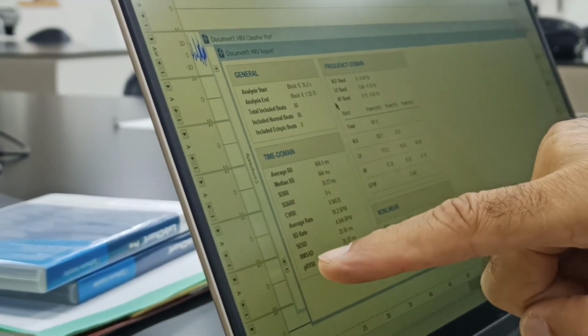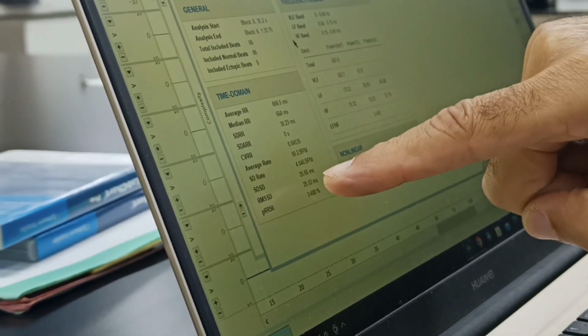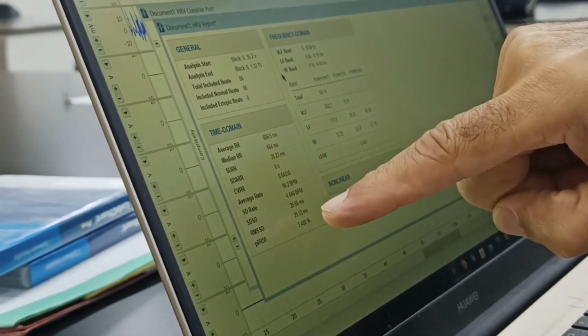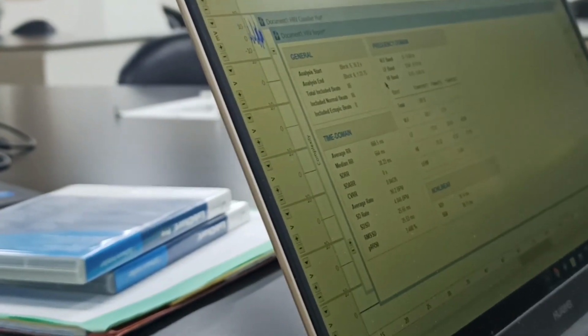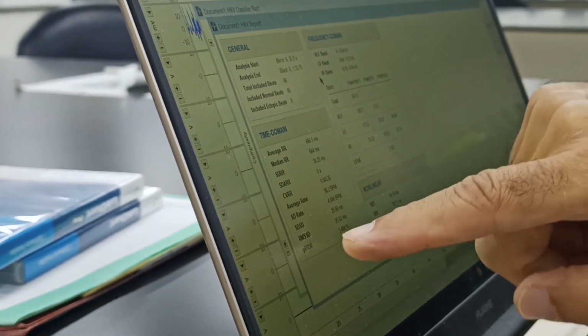Then we go to this RMSSD, again a statistical thing. It is usually close to whatever you get with SDRR. So that is 30, and this is around 25. They are not very different from each other. But I'll tell you later on, because that is purely statistics, so we will not spend much time here.